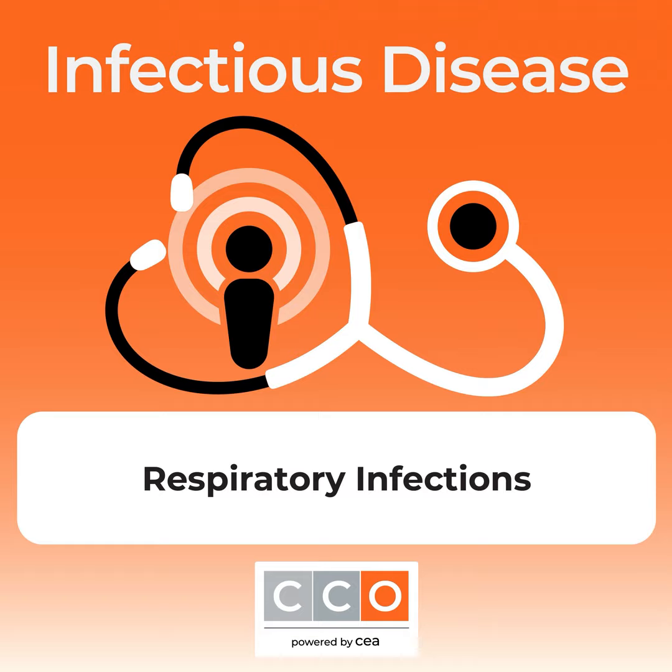And for that reason, it's really important that these syndromic panels are wonderful rapid tests, but they're really an adjunct to culture and antimicrobial susceptibility testing. They don't replace those. So why culture? As I just showed you, it's really important to be able to identify organisms in culture that aren't on the panel, including fungi. And I think there's also value in knowing that there's live replicating organism in there and not just DNA. And importantly, although the resistance genes are nice that are included in these assays, they're not a replacement for susceptibility testing of an isolate that you recover in culture.